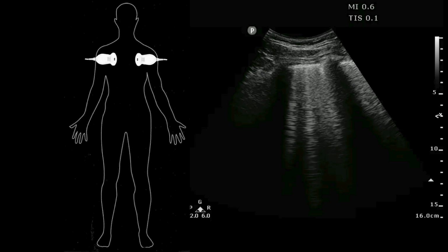We'll start that again just to let you see it there. So as they're breathing, it moves back and forth, right? It's been called a number of different things, lung sliding, ants marching, etc. But it gives you that context of some motion, right? And if I see that motion, I know a couple things, right? Number one, the patient's alive and breathing, right? That's important. Hopefully my ultrasound isn't helping me diagnose that definitively and I can look at the patient and see that as well, but it provides some reassurance to augment my clinical exam.